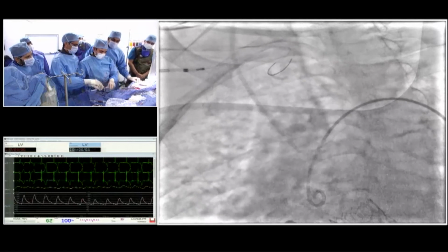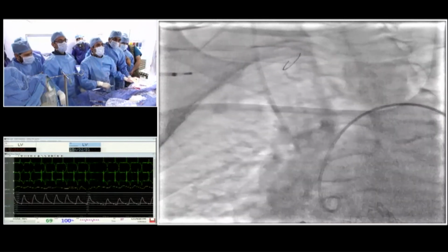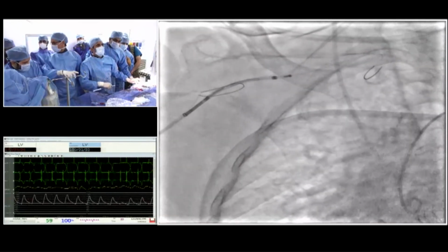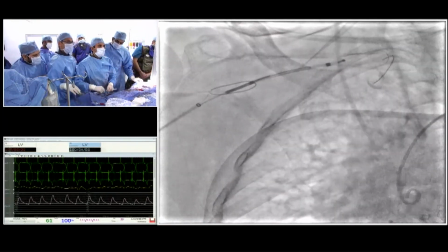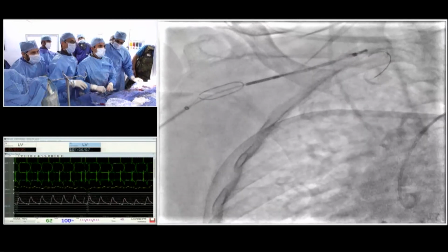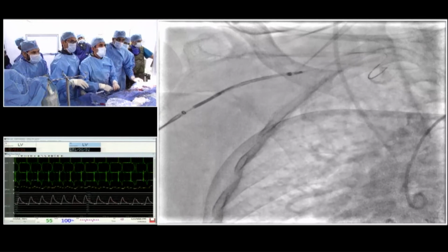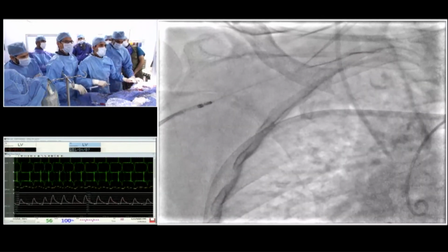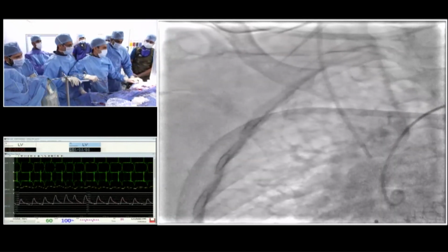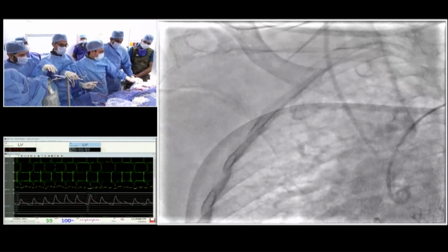We're going to lock it again, and then let's see, show me the proximal part. You're not able to capture that one, the number one? Capture. Yes. Okay. So you've got to push that forward now. Push that forward. Yeah, there you go. Recapture. Got it. So captured it. Yeah. So that's a problem with the tortuous and that calcified segment. And then you maintain the forward pressure on this knob and then pull it out.